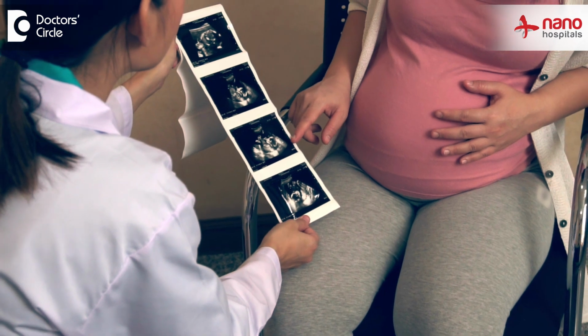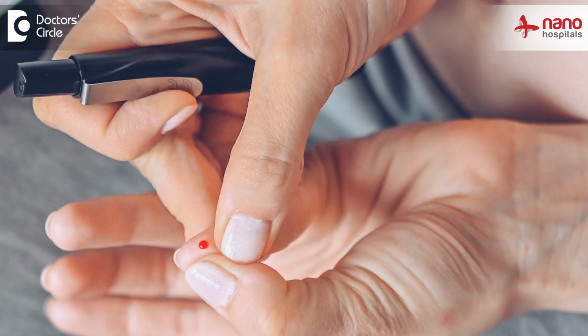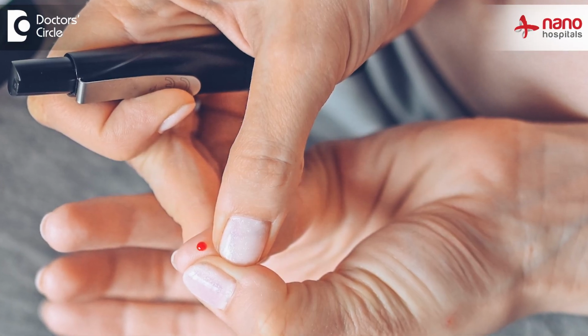If they specifically have these, then we also see whether there are any changes in the ultrasound in terms of the baby's growth. So these are the points that we note in a growth scan, and how many growth scans are needed depends upon the patient profile. We can do 2 growth scans in an interval of 4 to 6 weeks, or sometimes it may be more frequent when the mother has any medical complications like hypertension or diabetes. So that's the importance of growth scans.